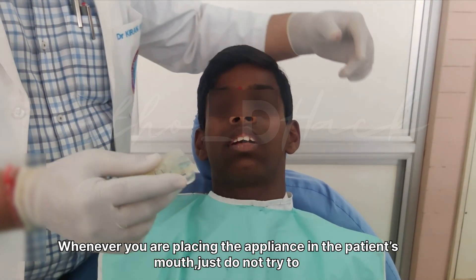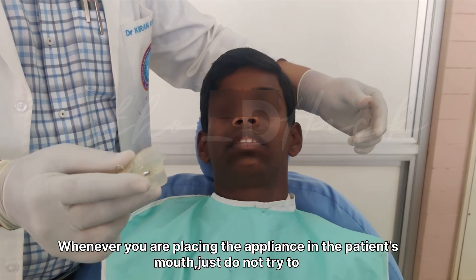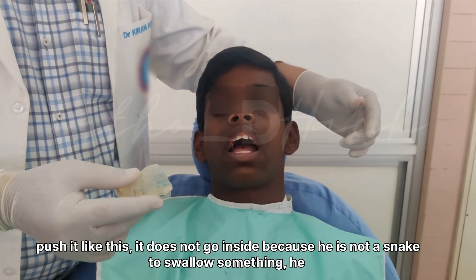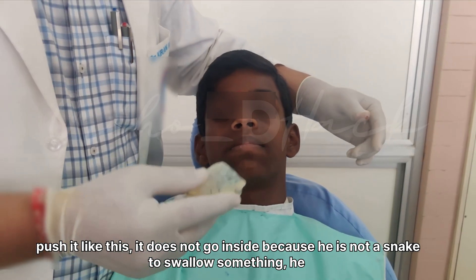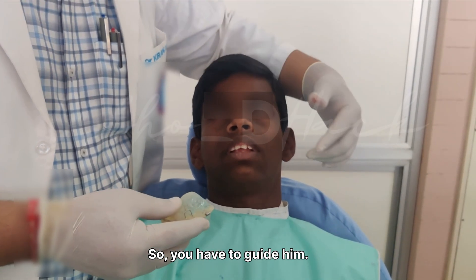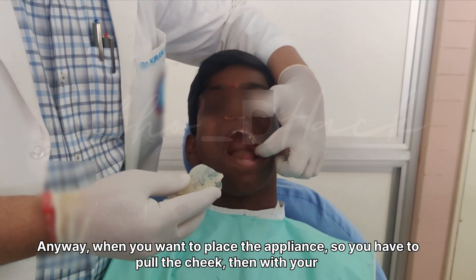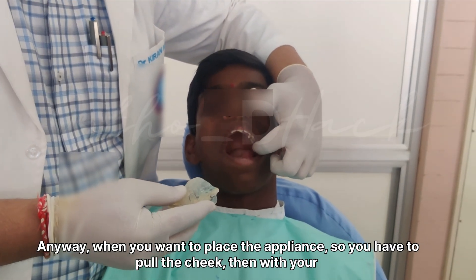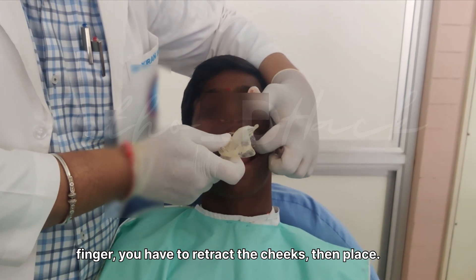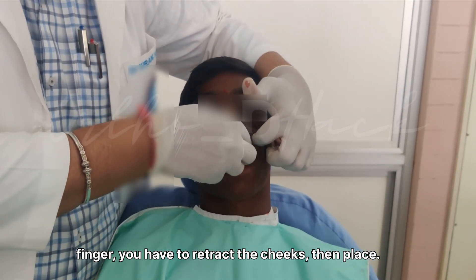Whenever you are placing the appliance in the patient's mouth, just don't try to push it in forcefully — it doesn't go in that way. You have to guide it. When you want to place the appliance, you have to pull the cheek, then with your finger retract the cheeks, and then place the appliance.